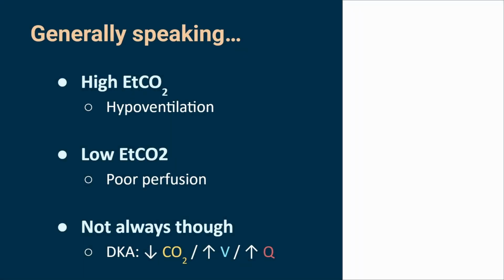So this is what most people think of. Most people will go their entire careers only thinking these two things with end tidal, and they will be okay almost always, which means that if you must retain the barest minimum of information, it's this right here. Generally speaking, high CO2 is hypoventilation. You don't breathe, your CO2 builds up, so every breath you take is a lot of CO2. What 80% of the time people are using it for is a sign of poor perfusion.